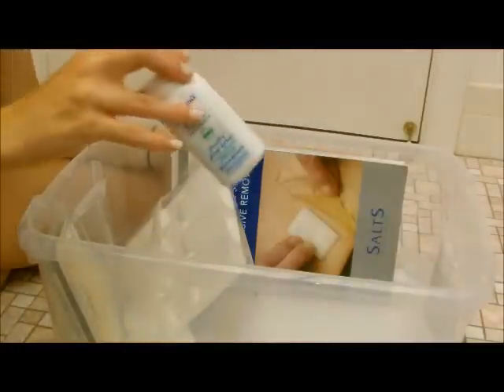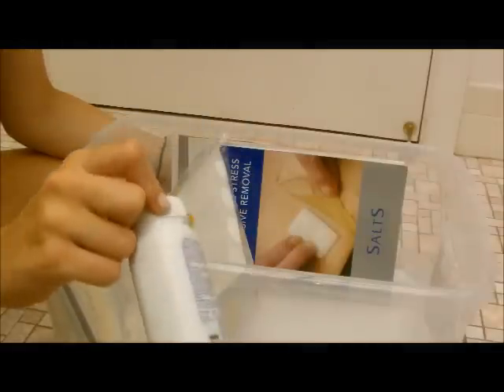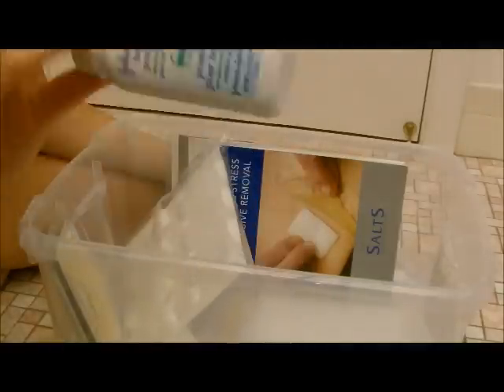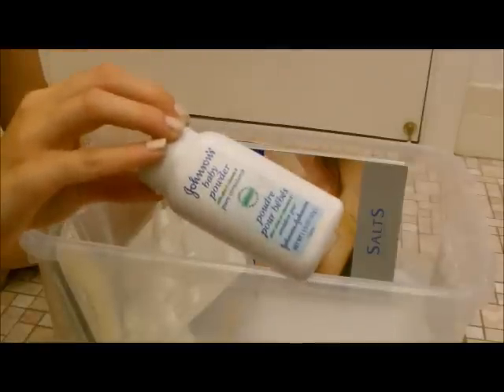I have baby powder. I don't really know what that has to do with ostomies, but I keep it in there because, I don't know. Baby powder helps dry stuff. So sometimes I will put it underneath my bag, like after I get out of a shower. But, yeah.